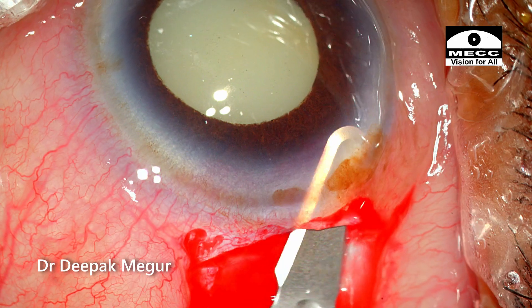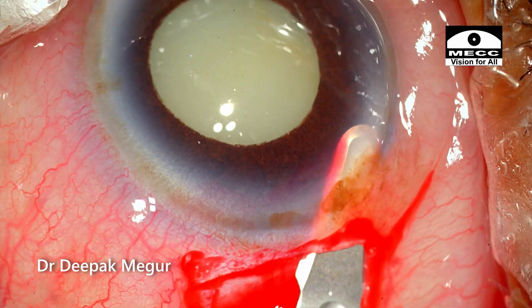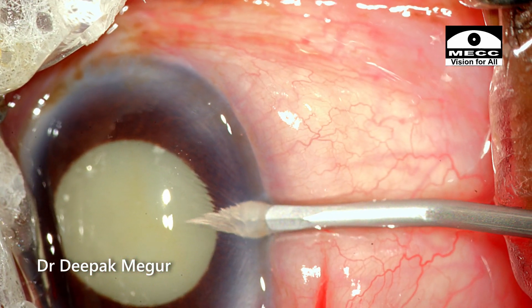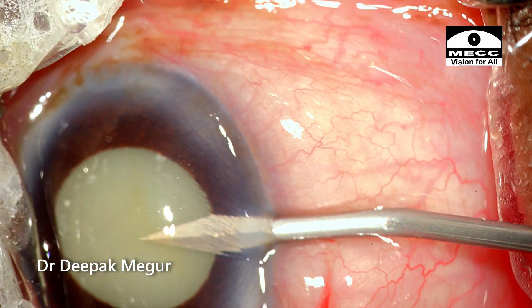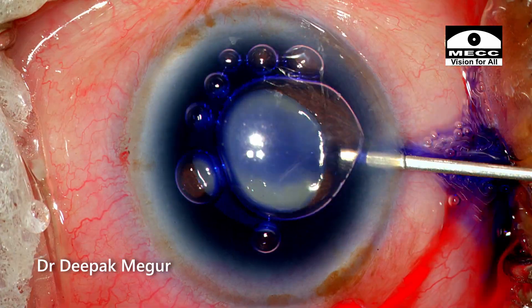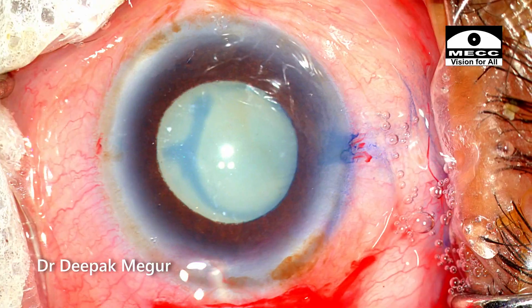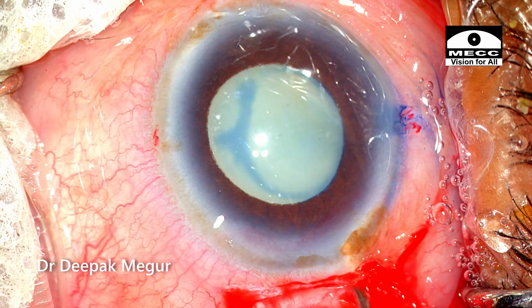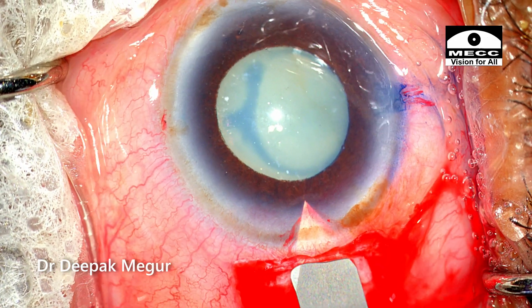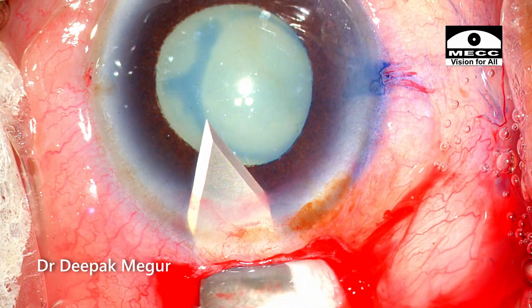The scleral tunnel is extended on the other side as well. I am creating two side ports. The capsule is stained and the OVD is introduced.